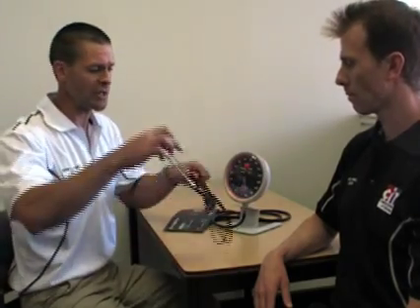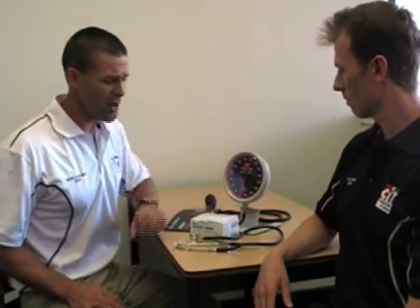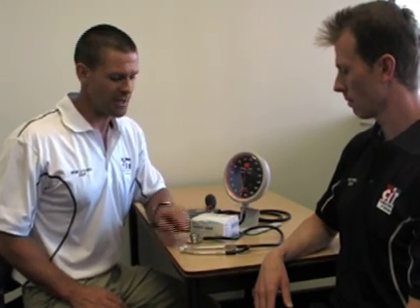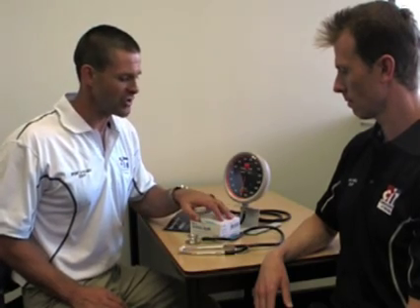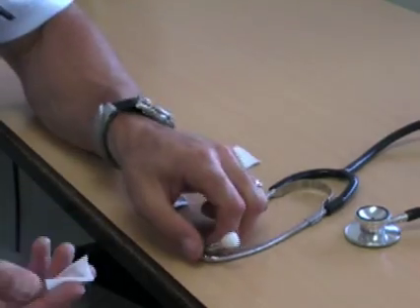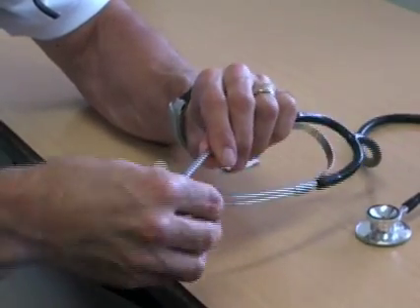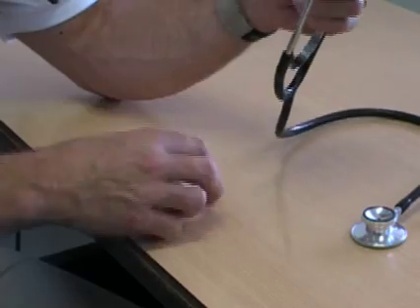You also need a stethoscope, which is used for listening to the heartbeats as you release the valve on the blood pressure cuff. You also need alcohol swabs, as hygiene is very important. A number of people will use the stethoscopes, and since they go into your ears, make sure that after your fitness assessment you take an alcohol swab and clean each earpiece so it is ready for the next instructor to use.